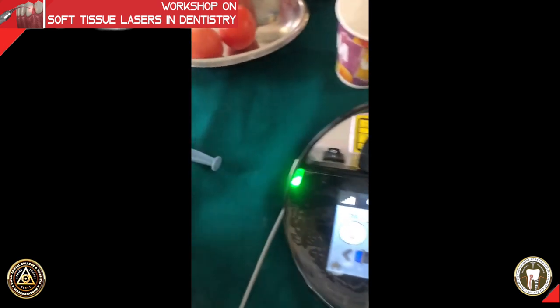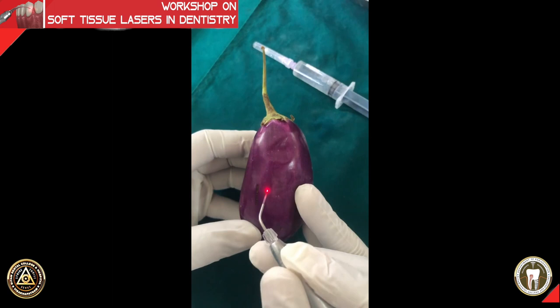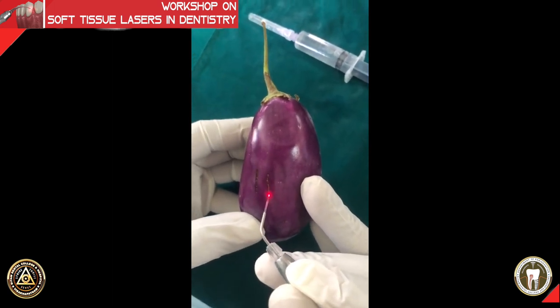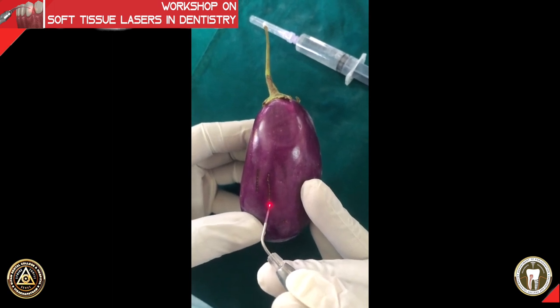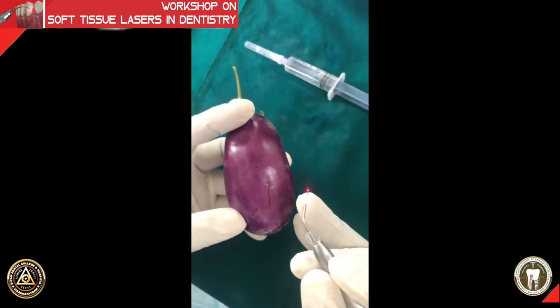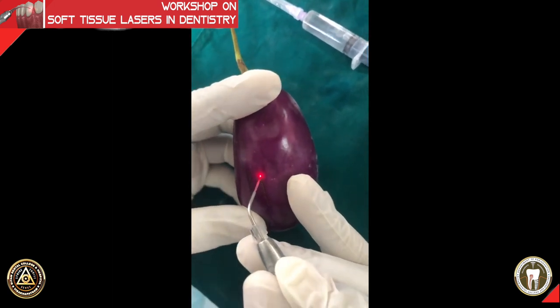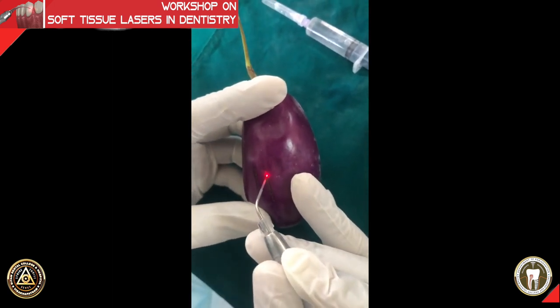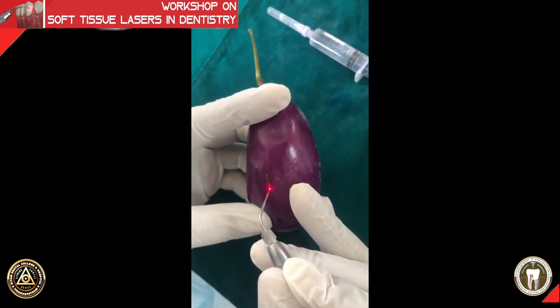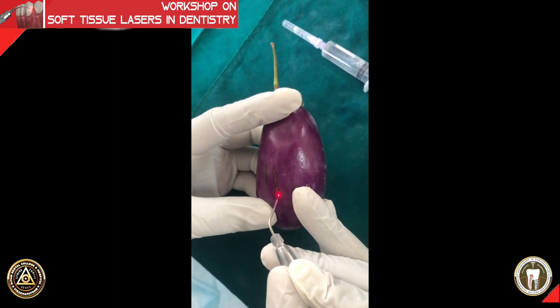We are using a lower power in continuous wave mode. You can see how sir is moving it slowly so that cutting happens. You need to do what is called layer cutting — in the same place you have to give repeated incisions. Unlike a blade, a laser will not chop off the tissue, so for a gingivectomy, crown lengthening, or any surgical cutting procedure, you cannot chop the tissue.